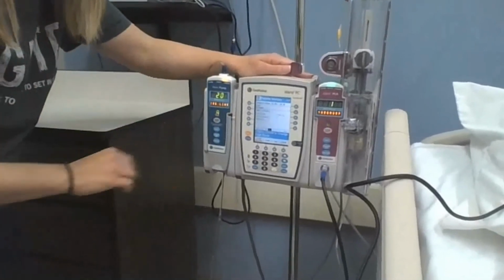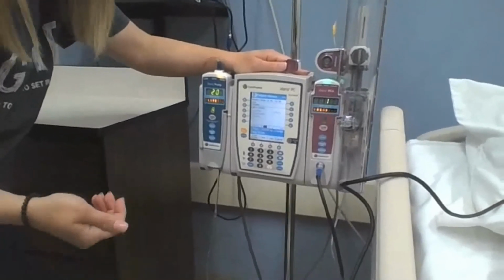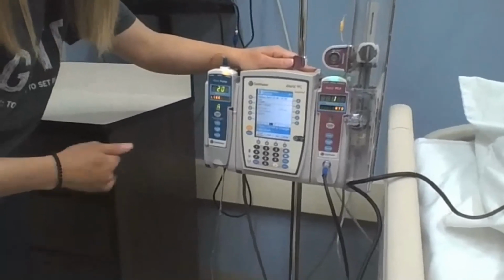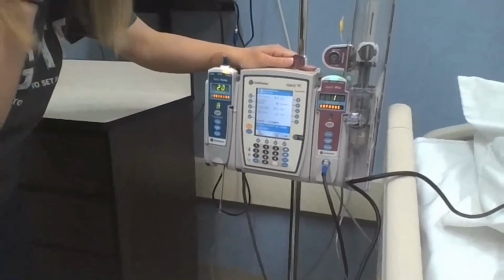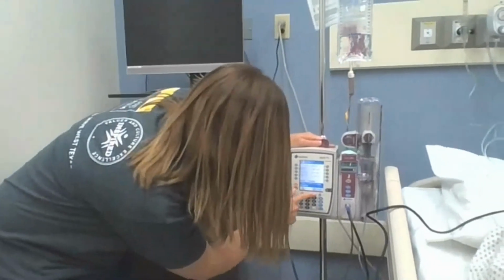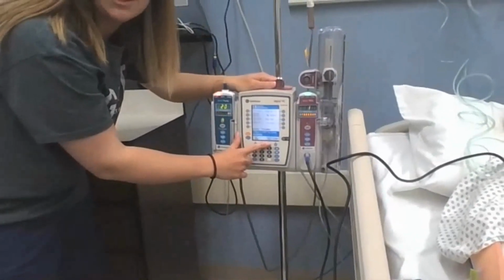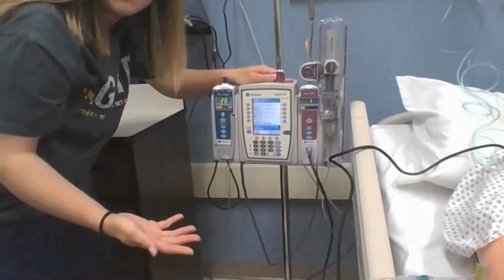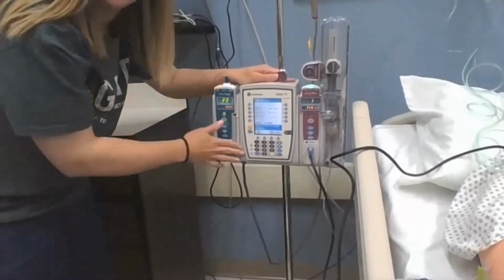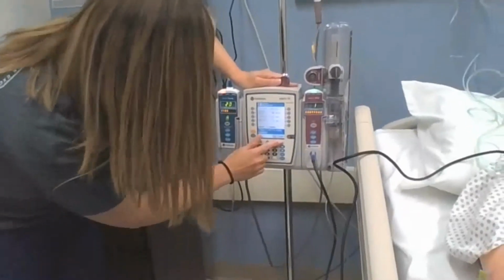So if there's a discrepancy there, that might indicate that maybe your patient has poor pain management. They hit the button 5 times, but they were only able to get it once. So that's a good indicator that you need to reassess their pain, make sure it's managed, see if you need to call the doctor and make any dosing changes. You can also program bolus doses in here if the physician has ordered additional bolus doses. It's not common that they would do that, but it certainly is possible. We've done it before, but you want to be very careful. But you can bolus them from the PCA and account for that drug in here.